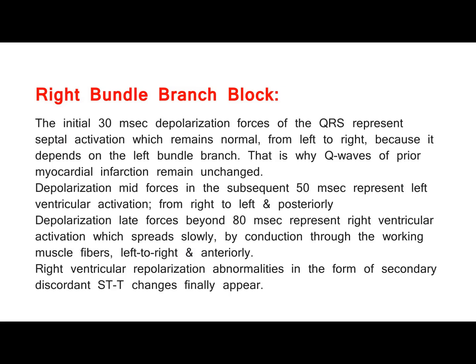Depolarization late forces beyond 80 millisecond represent right ventricular activation, which spreads slowly by conduction through the working muscle fibers, left to right and anteriorly. Right ventricular repolarization abnormalities in the form of secondary discordant ST-T changes finally appear.